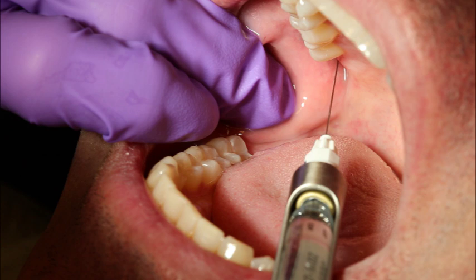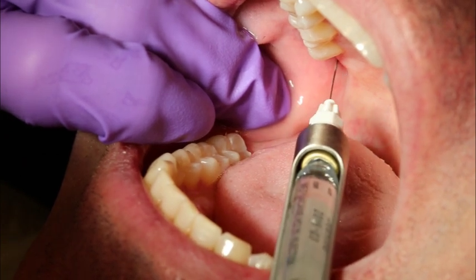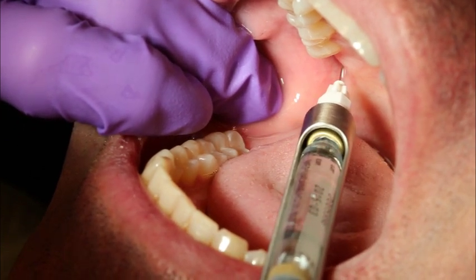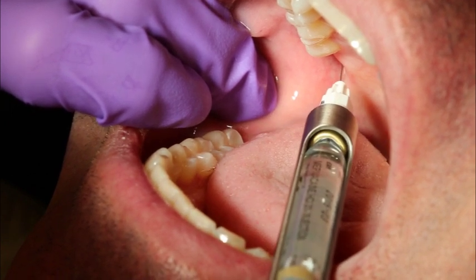Insert the needle parallel to the determined imaginary line until you gently contact bone with the neck of the condyle, approximately 3/4 the depth of the long needle. Aspirate within 3 planes to ensure that the bevel of the needle is not abutted against the interior of a blood vessel, providing a false aspiration.